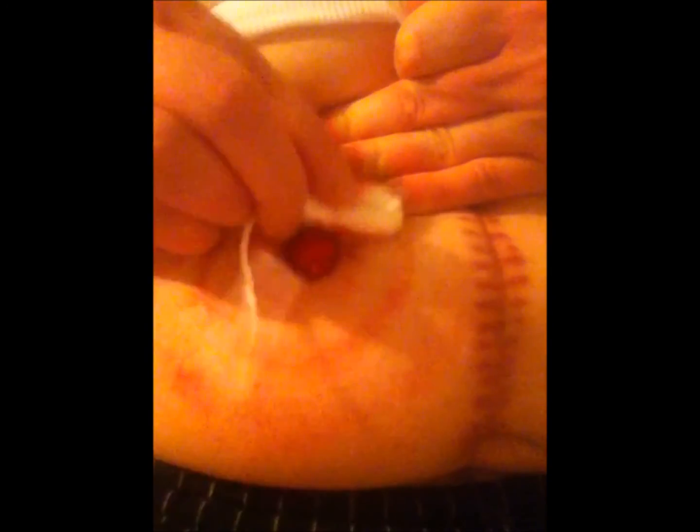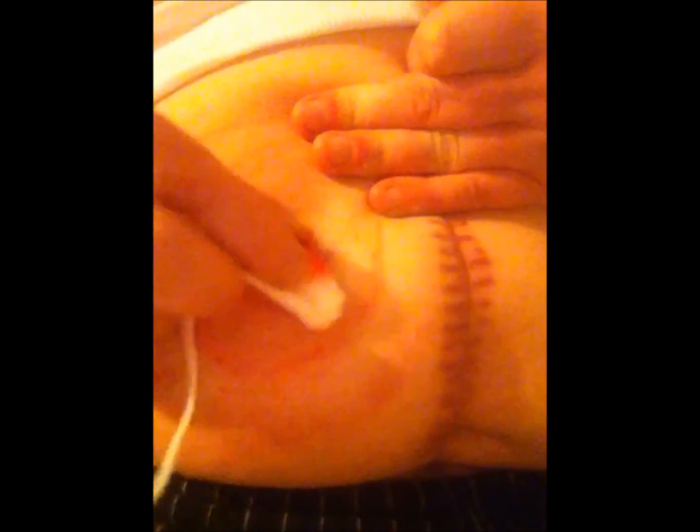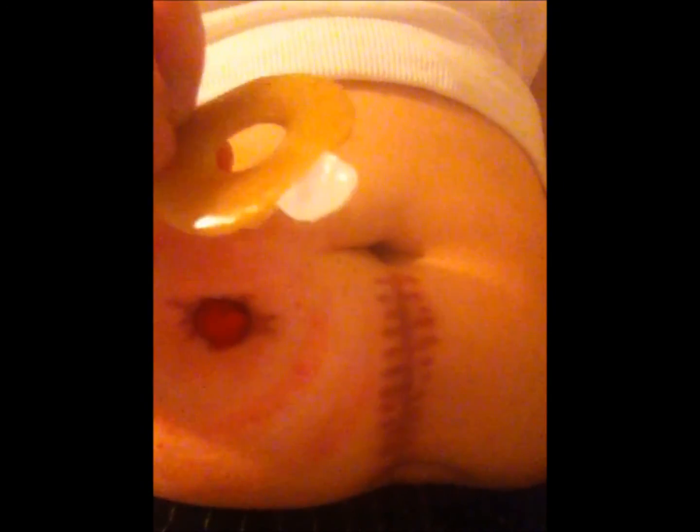That's what we want. Then I've got my barrier, and the reason why I use this ring barrier is because it does kind of go into my belly a little bit, and I did lose a few stitches on this side, probably because I was doing too much and I'm just stubborn. But in any case, it sticks into my belly, so I take that off, and then I take off the top layer, and then what I do is I stick it onto this.